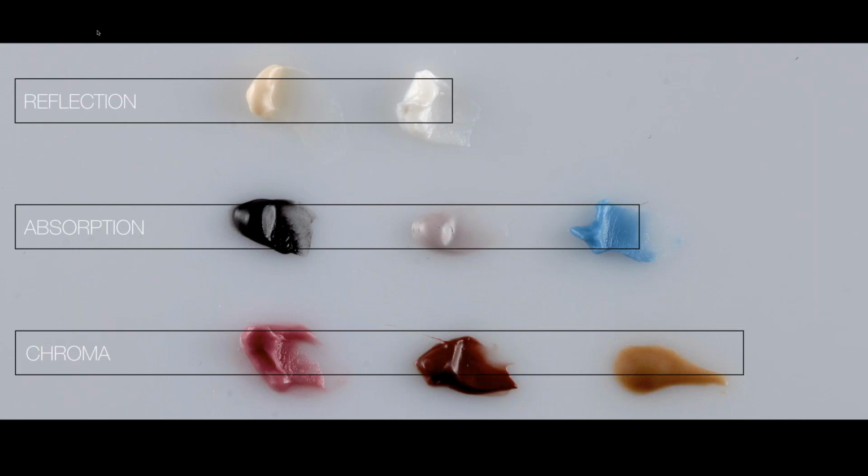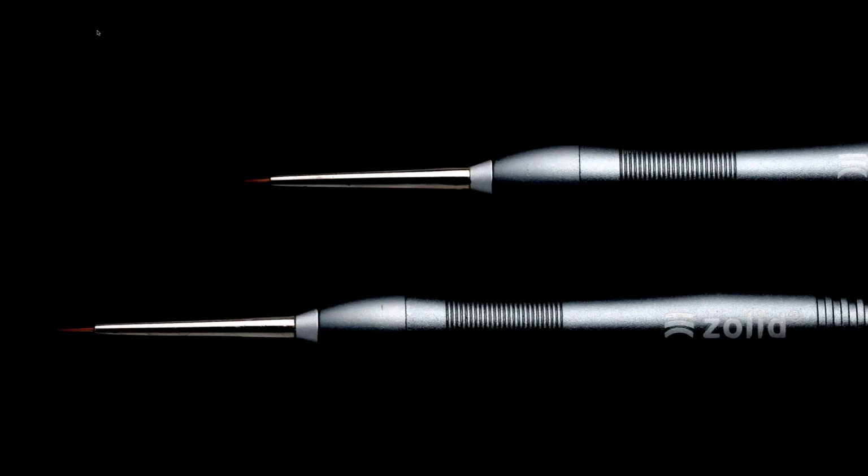And chroma, or aka base, which depends on the desired color of the final restoration. Also, it is important to have a good tool for this color application. We use Zolid FX Revolution brushes powered by MPF. They have an ergonomic design that simplifies the handling, and optimum size and hardness of bristles for applying small amounts of color.